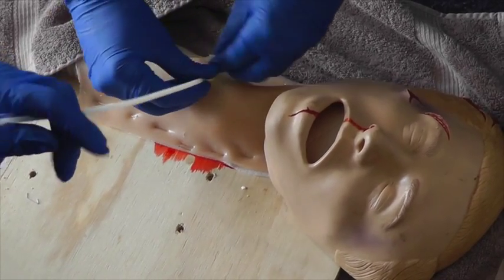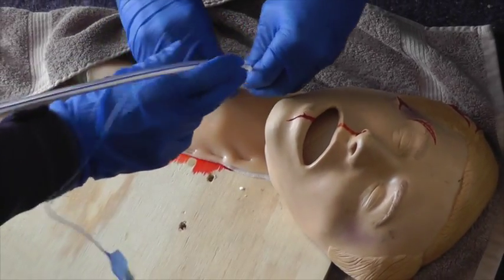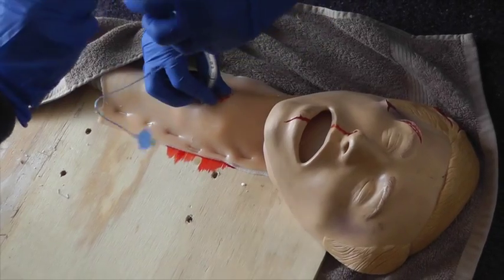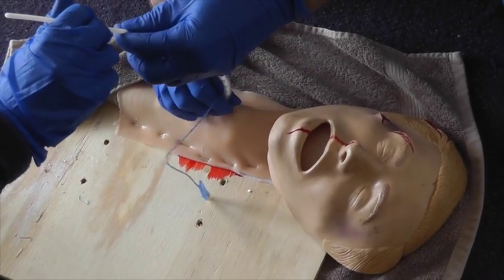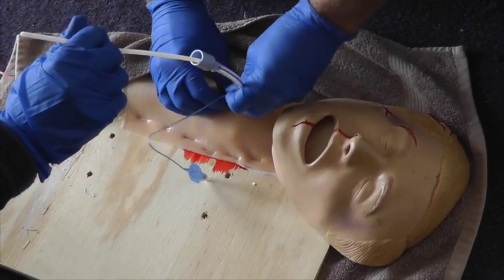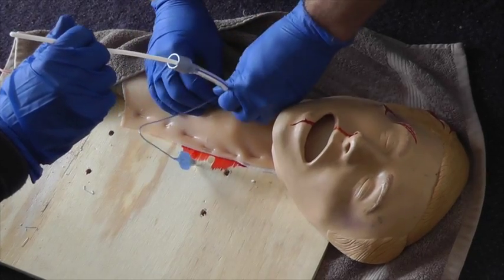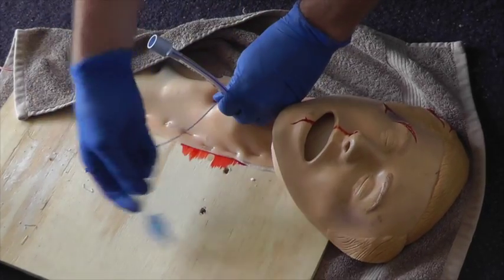Tube over the bougie. I've got the tube over the bougie. I've got the bougie. I have the tube. Passing the tube. It's in — bougie out. Inflate the cuff.